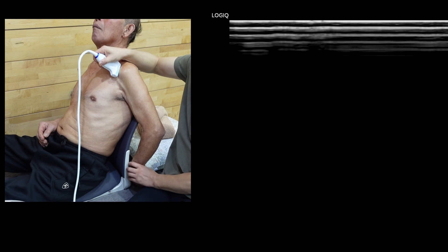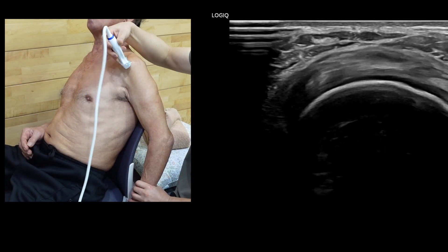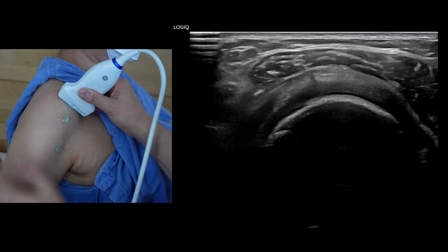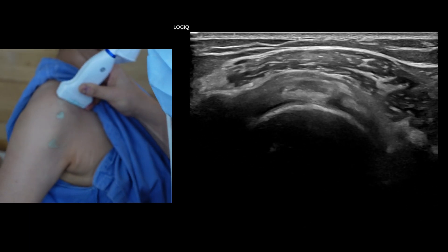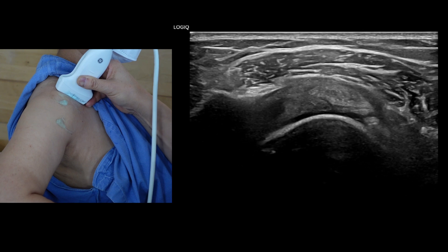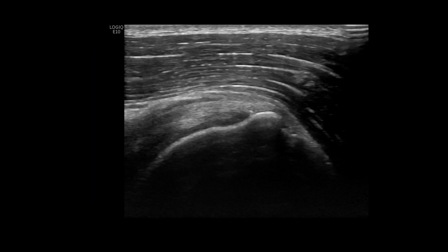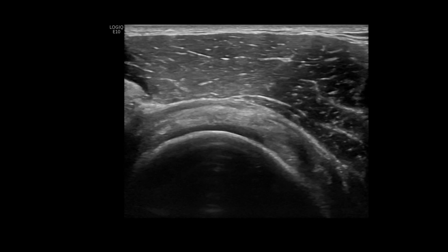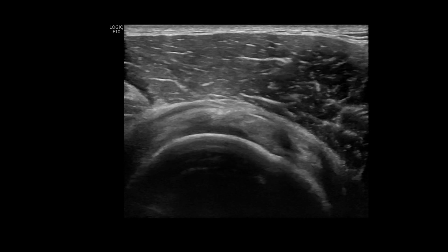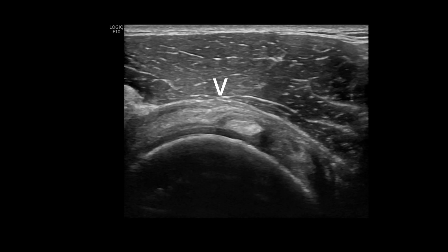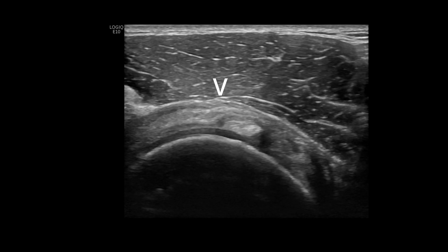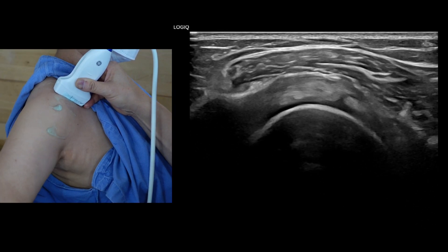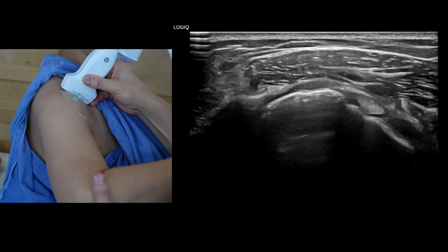Begin by assessing the supraspinatus tendon along both its long and short axes. Use the intraarticular portion of the biceps tendon as a landmark to guide the proper orientation of the ultrasound transducer. The biceps tendon of the rotator interval separates the supraspinatus tendon anteriorly and borders the tendon's anterior margin. Adjust the transducer direction until you can distinguish the biceps from the far anterior tendons, as young individuals may have minor tendon tears that many doctors might overlook. Sometimes, I move the humeral head to find pathology of the supraspinatus and subacromial impingement with dynamic real-time images.